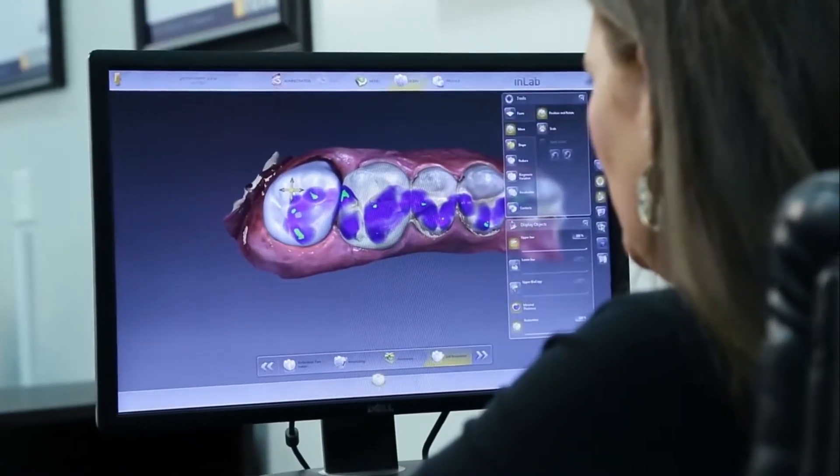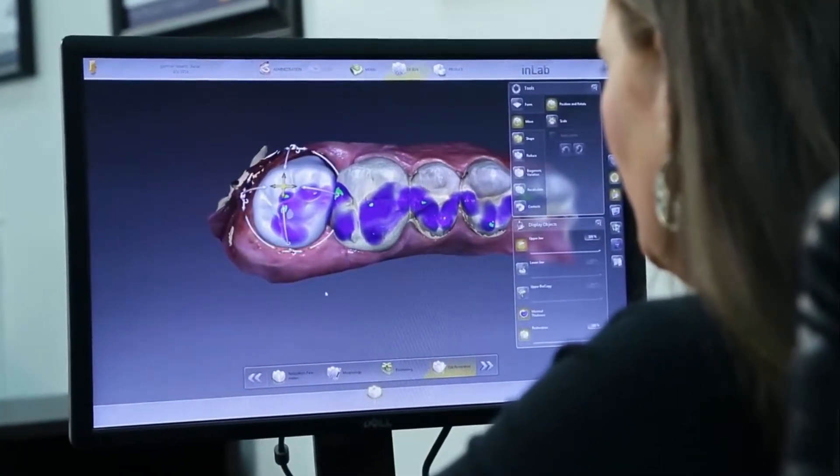Here you're getting a full contour zirconia and I'm sending it to the back. It's milling and then you process the color, the shade, everything — and out the door. You can have it out the door same day.